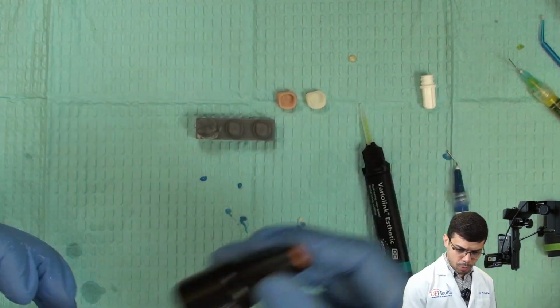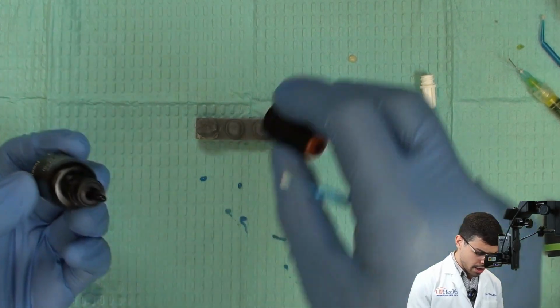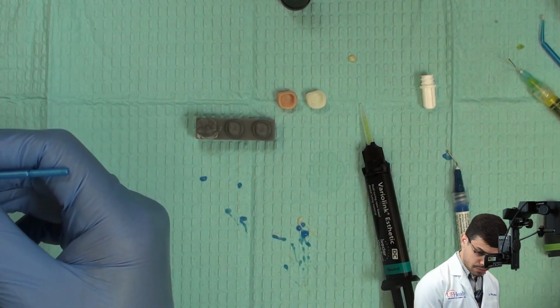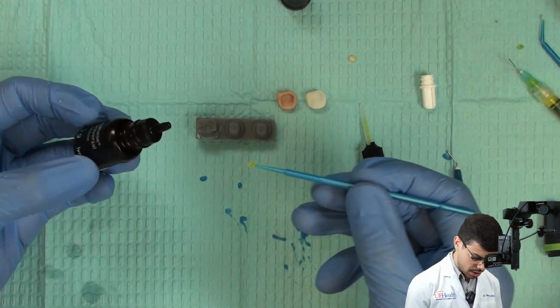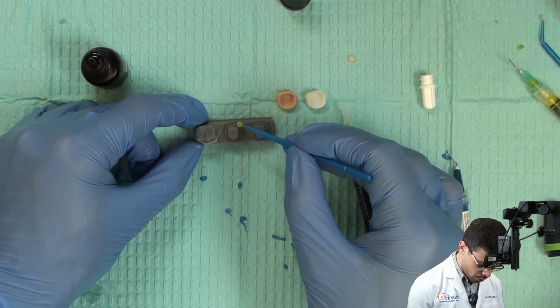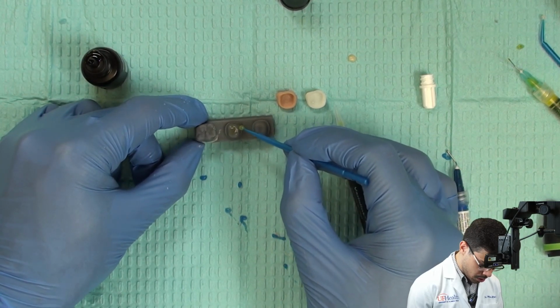Even clinically, there's no problem. I just don't recommend putting the air too strong on it. Now I'm ready for the adhesive system, okay? So I'm gonna get the adhesive system here. So I got a drop of the adhesive. Now I'm going to apply the adhesive on all surfaces, okay? So I'll start here on the dentin. The adhesive needs to be scrubbed.